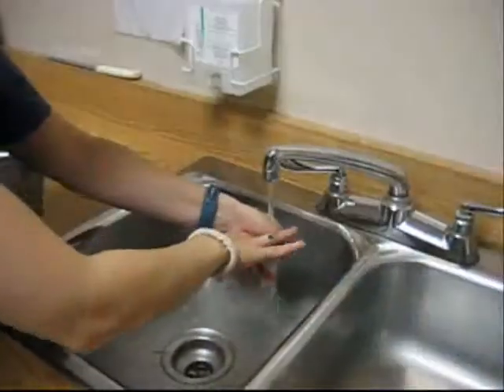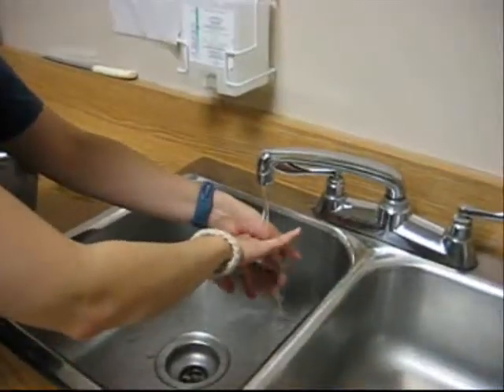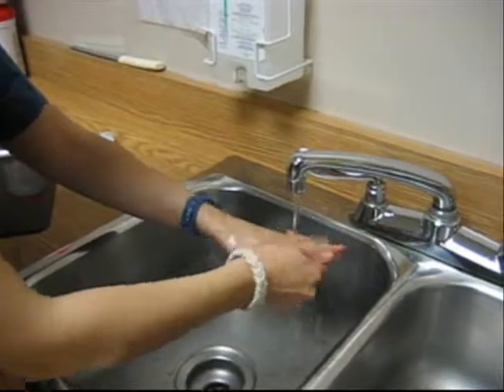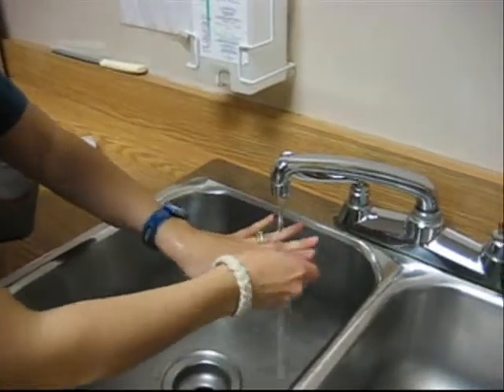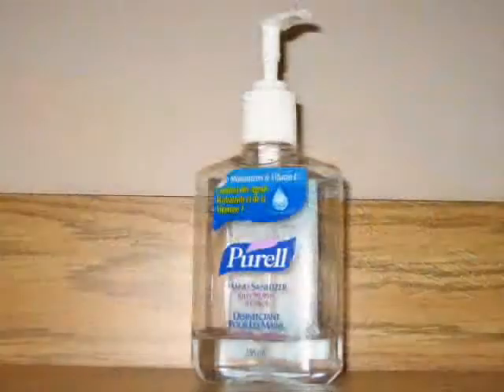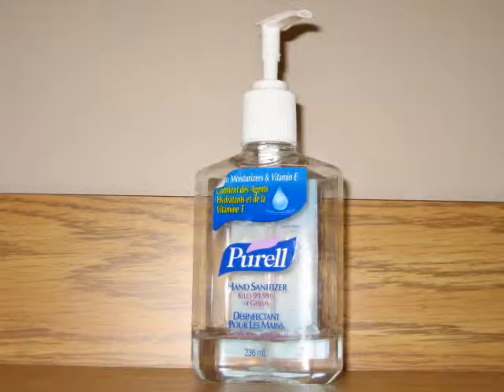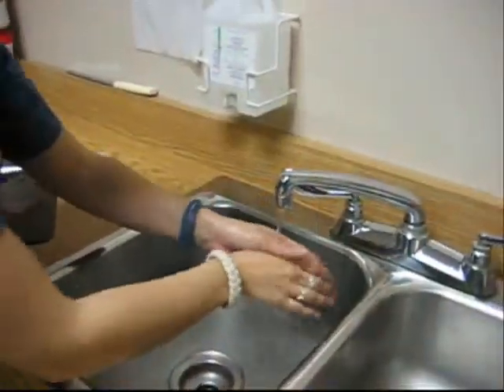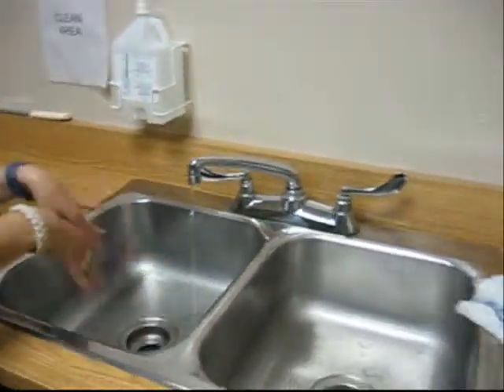Locate the equipment. Use professionalism and aseptic technique throughout the procedure. Ensure that hands are thoroughly washed at a sink or with an approved alcohol-based hand product prior to the commencement of the procedure and the donning of gloves.